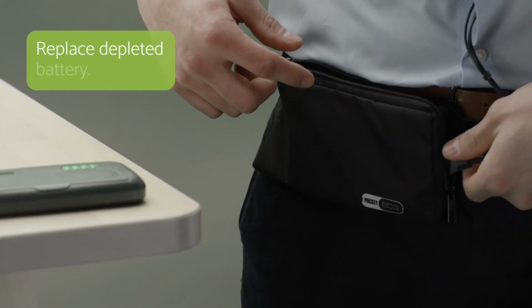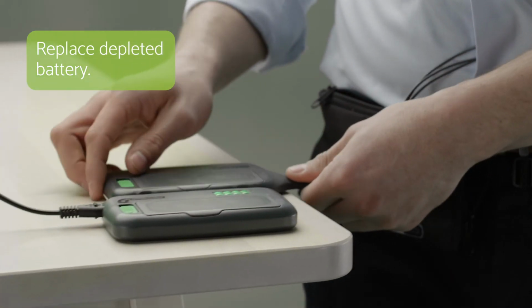When the battery in the monitor is depleted, it can be exchanged with the battery from the charging station.